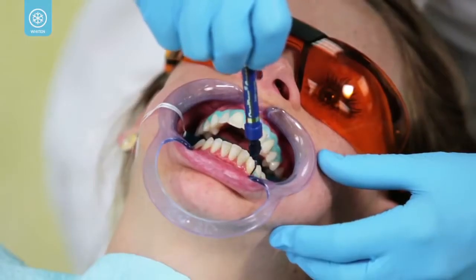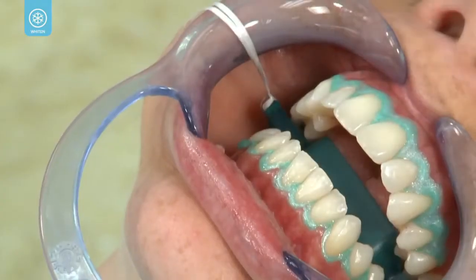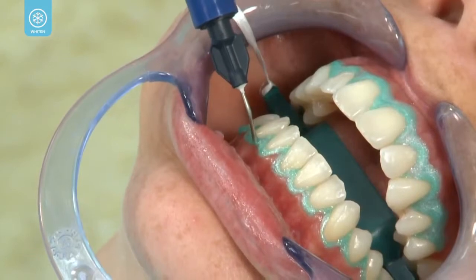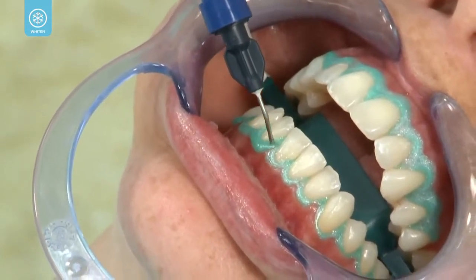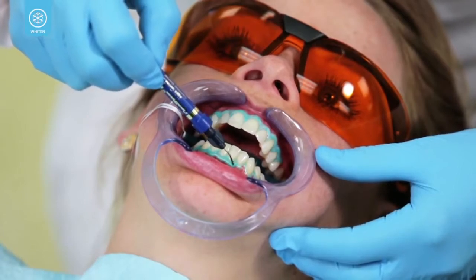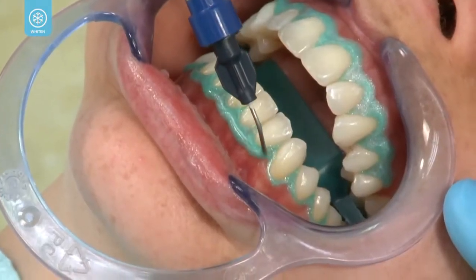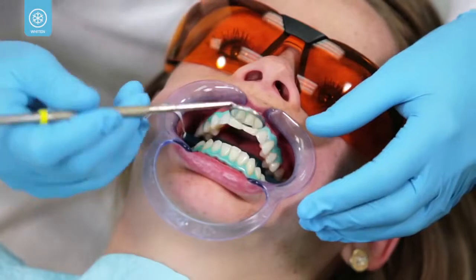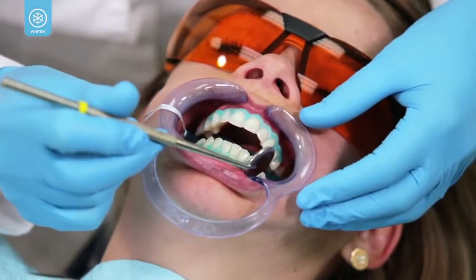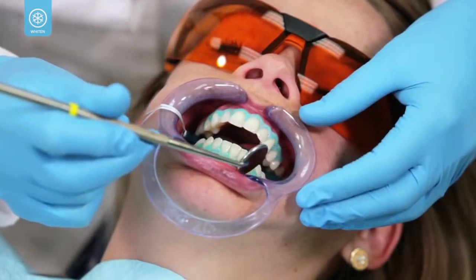Extend the resin one tooth beyond the last tooth to be bleached, and continue building the barrier apically until it is 4 to 6 millimeters high and 1.5 to 2 millimeters thick. Visually check that all gingival tissues at the resin margin are covered and that a good seal is established. Using the mouth mirror, look up the long axis of the teeth and reapply the resin to any minute openings.